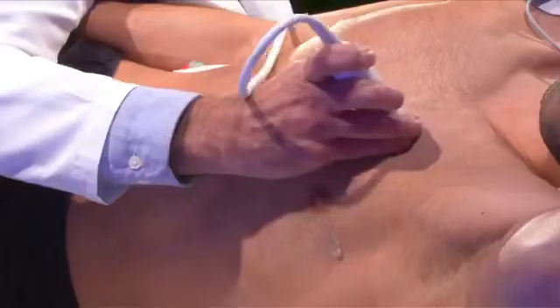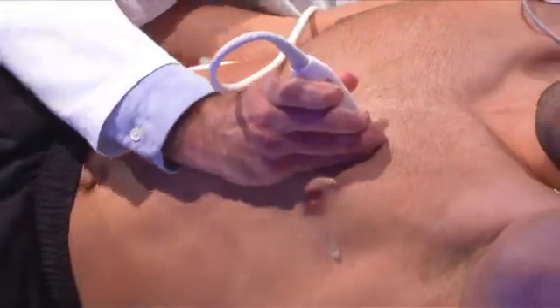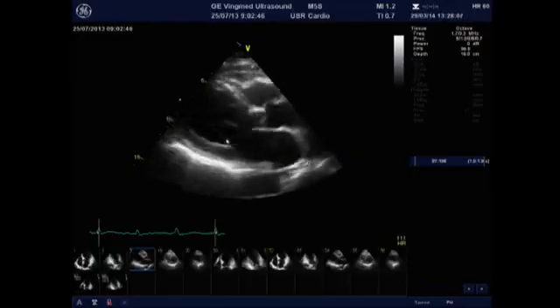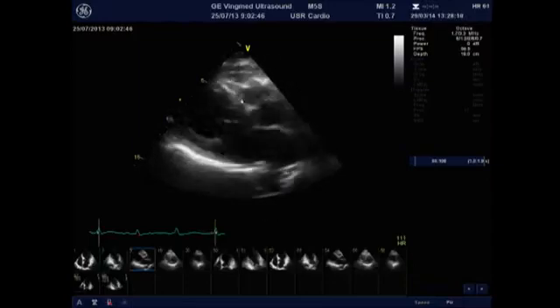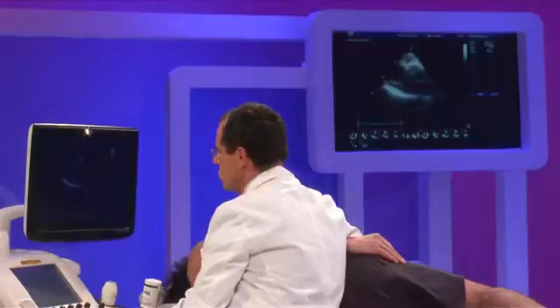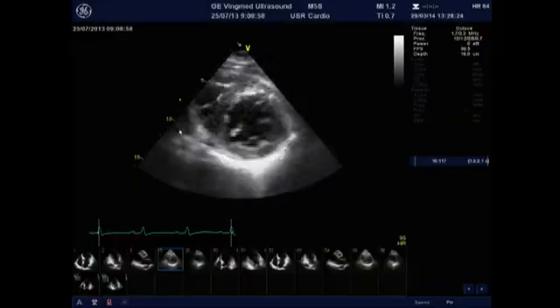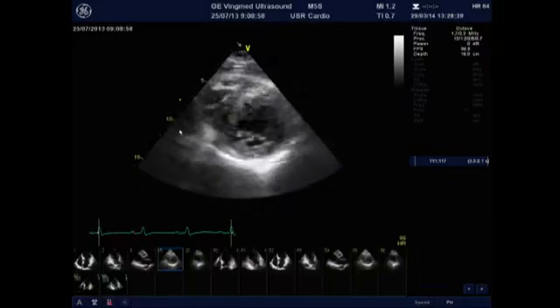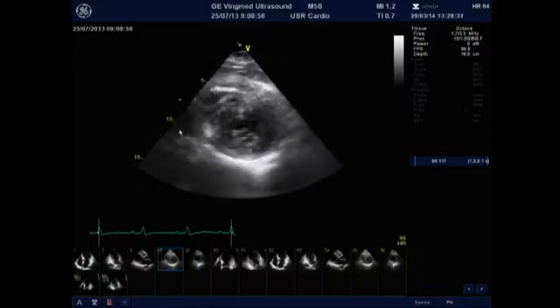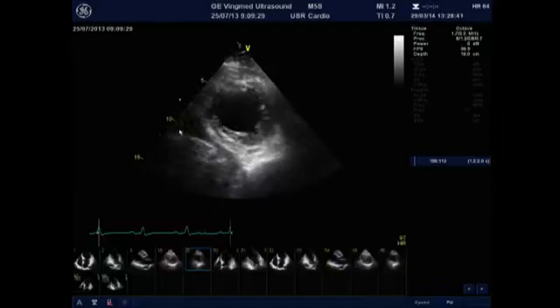And this is the parasternal view. Just a little bit more gain. And exactly the same impression. Basal segments okay, and the anterior septum is akinetic, as well as the medial segment of the posterior wall. Now I'm going to try to see just the short axis view, at the level of the mitral valve, confirming that LV function at this level is okay. And now I'm going to the apex, and the function is severely depressed.